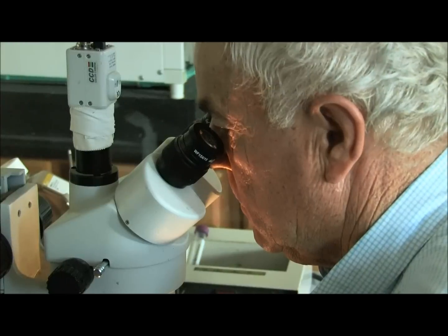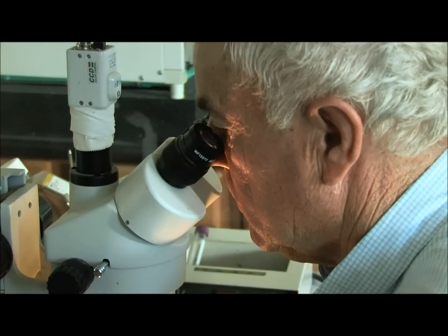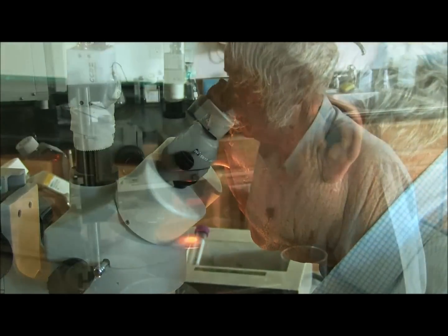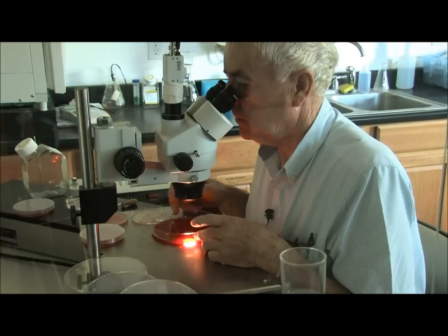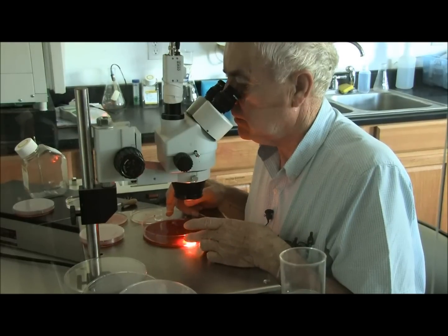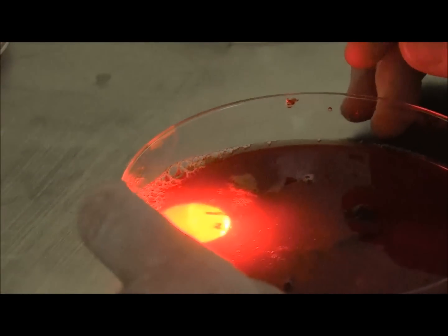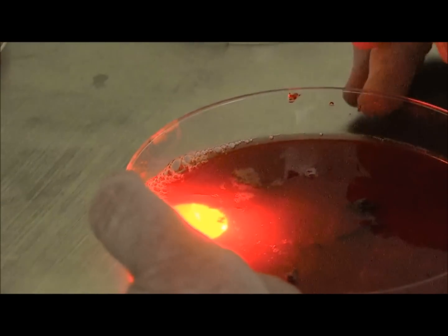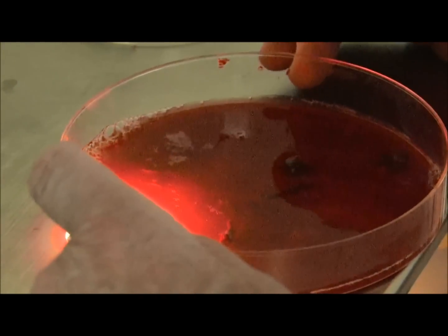Once the aspiration is complete, the syringe with the fluid that was aspirated from the follicle is placed in a search dish and then under the microscope. The job is to find the microscopic oocytes which have been collected from the follicles.